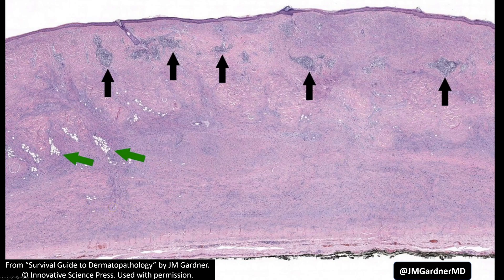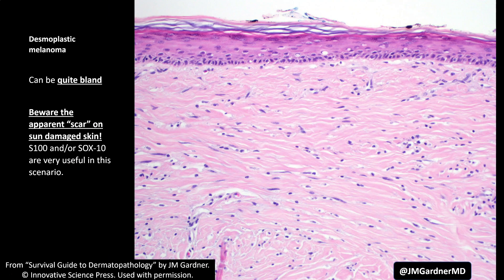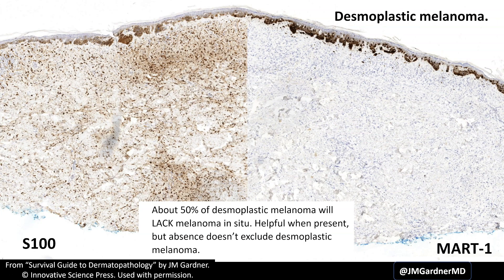Here are some pictures from my dermatopathology survival guide to highlight what we discussed. On one side we have S100 with striking staining throughout the dermis, and on the other side those atypical spindle cells are totally negative for MART-1. This particular case had a tiny nested component and a melanoma in situ component that stained with MART-1, but the rest of the lesion was totally negative and only stained with S100. This illustrates that MART-1 and HMB-45 are usually not present in pure desmoplastic melanomas.